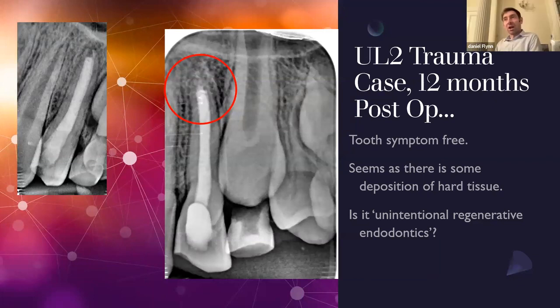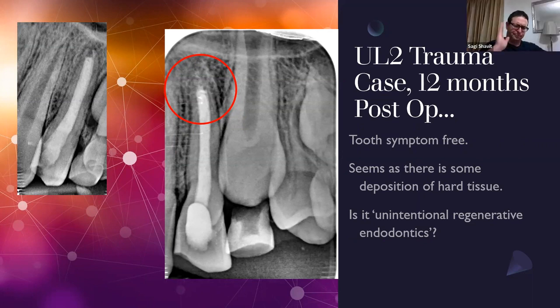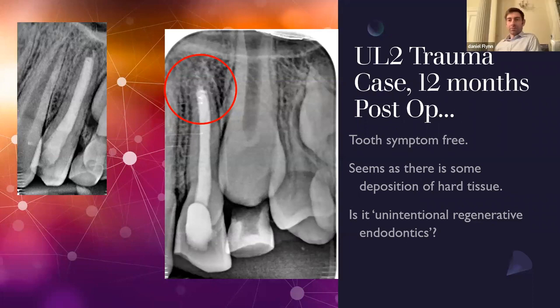That's why, I mean, I've tried a lot of the different putties and sealers, and having one that has a fairly quick initial set makes a big difference in terms of predictability, just not being afraid of washout. Whereas absolutely, when I use MTA in apical surgery, I could never do that. I used to wash out. If I was to spray MTA, it would all wash out straight away. Becomes soup. It likes water in the first 4 hours of its life. Yeah, it's hydrophilic. And I had lots of issues with apical surgeries when I would go back into them years later. The material just wasn't set because the blood would infiltrate into the actual material.